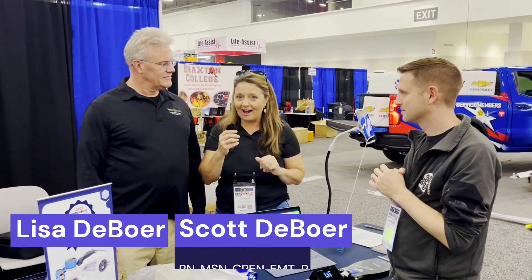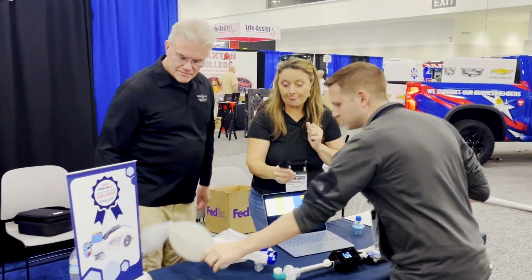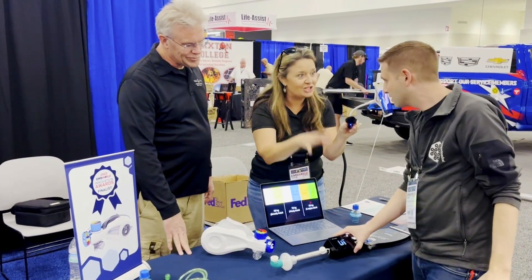Hey, it's Lisa DeBoer and Scott, and we're here at EMS Expo live for your Gimme 5 on Friday. We've asked Jonathan Merrill one more time to show us what he's been working on and how things are going with the Butterfly BVM. We asked people to say, I know you guys are peds-centric, but I'll start with an adult-focused demo.